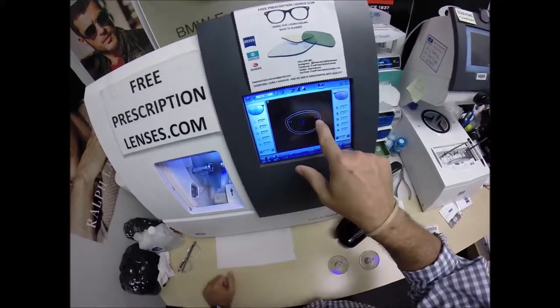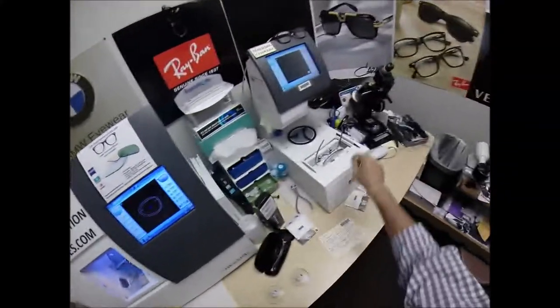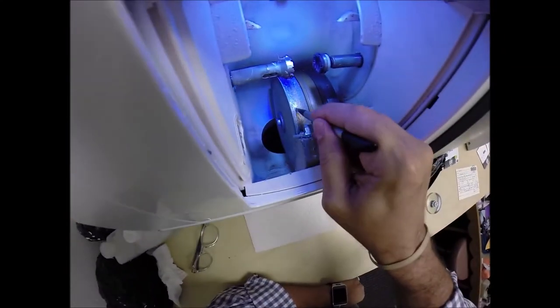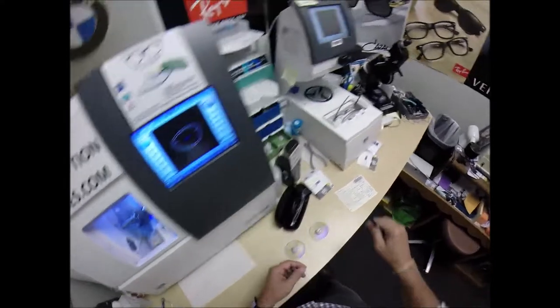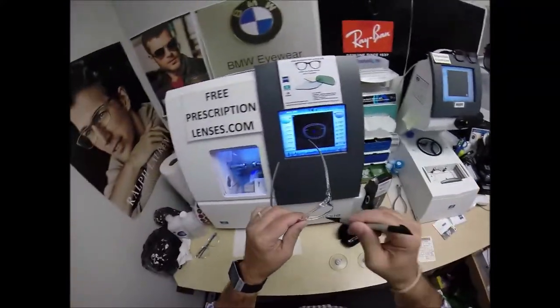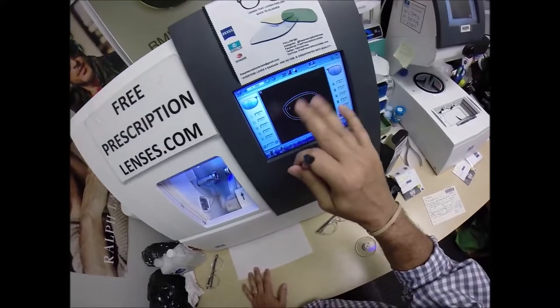Look, I just cut a silhouette lens. You can see the drill holes in there. But the actual cutting wheel is this diamond crested wheel that's going to grind away your lens material. This wheel in the center is going to put the V-shaped bevel on the lens so it stays inside the bevel of the frame. I'm going to wake up the computer. Bye-bye, Silhouette.